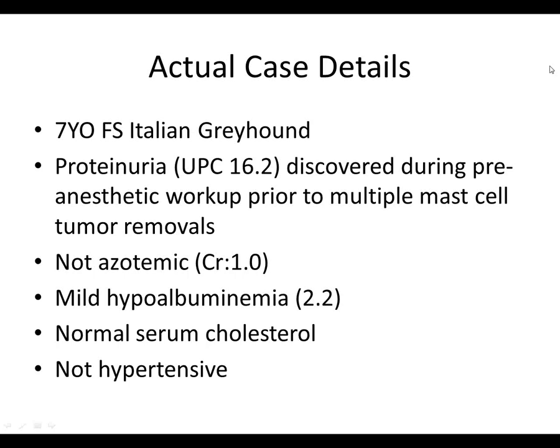So whether or not these are circulating immune complexes that then just get pushed into the mesangium, or whether you're actually making antibodies against mesangial proteins, it's really hard to say. I do think these are often kind of a chunky deposit as opposed to really good granularity. So again, we just don't have enough data right now to know the pathogenesis in dogs.